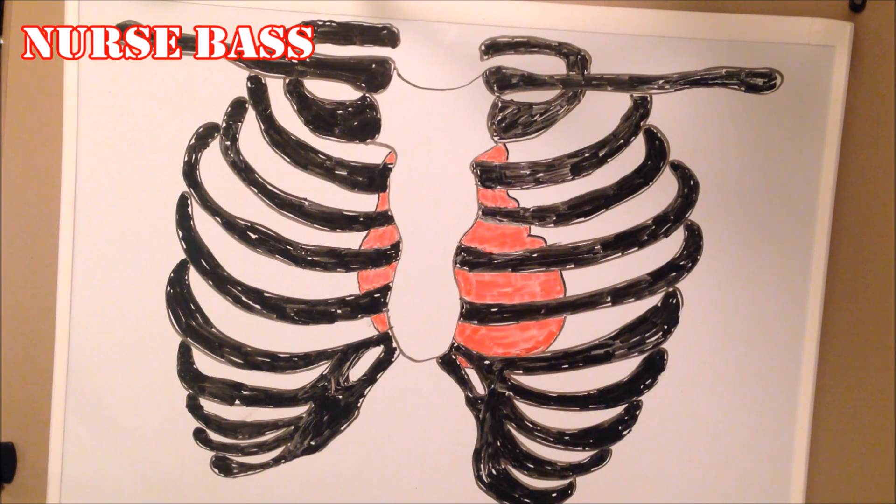What's going on guys, it's your boy Brad and I'm back with another video. What we're going to be talking about here is how to auscultate heart sounds. This video is geared towards those of you out there who are beginners just getting into whatever facet of the medical profession you're getting into.